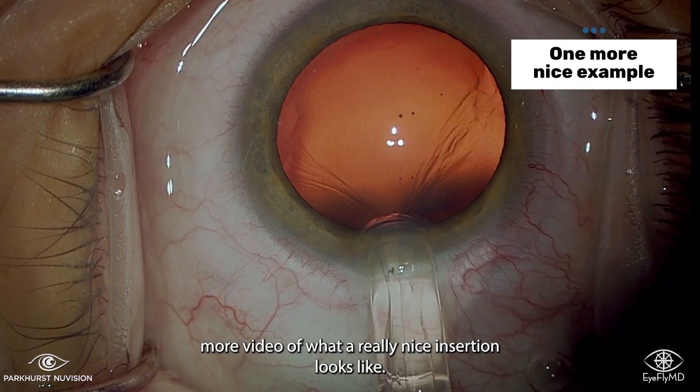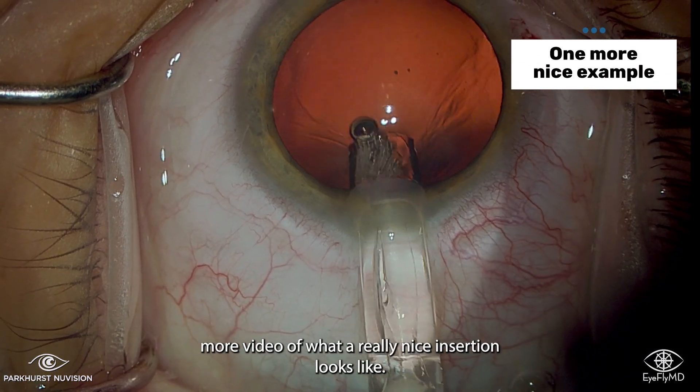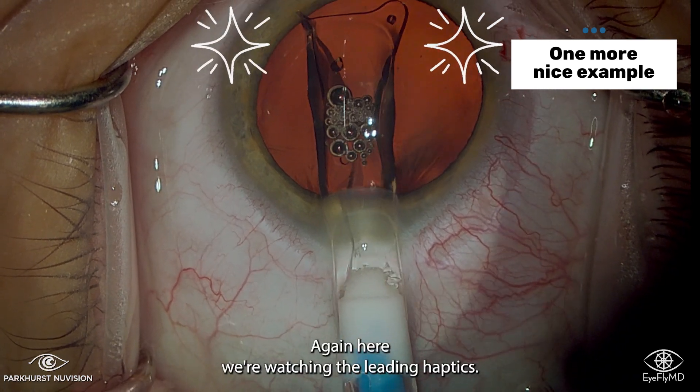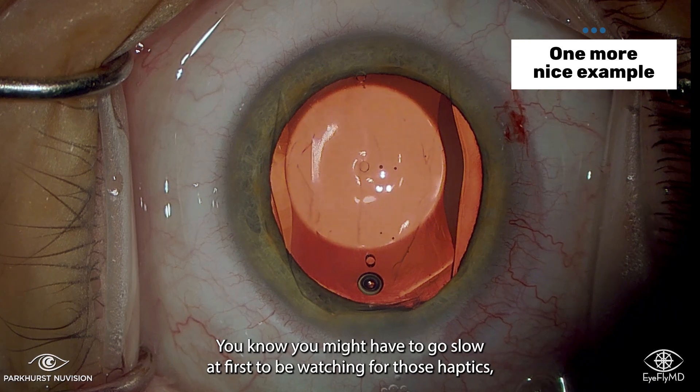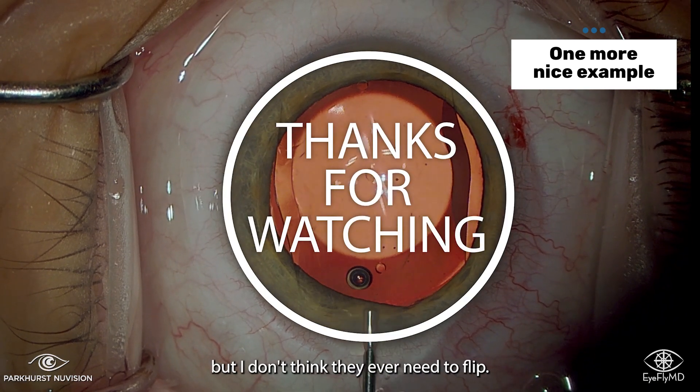Here is one more video of what a really nice insertion looks like. Again, we're watching the leading haptics — they open perfectly, just commit to it. You might have to go slow at first to watch for those haptics, but they never need to flip.